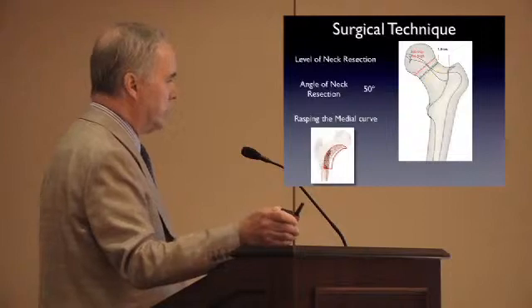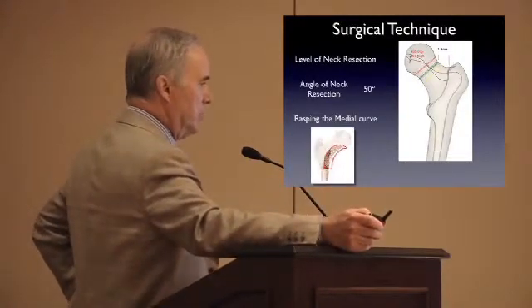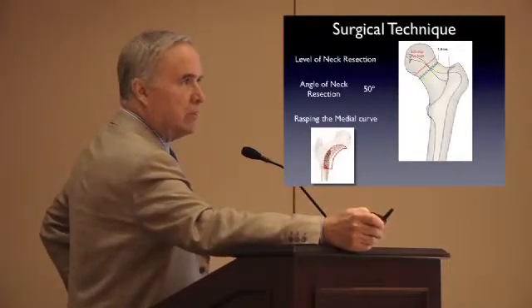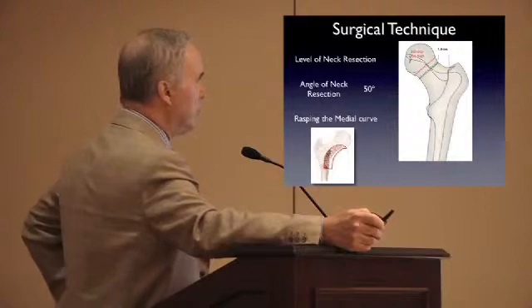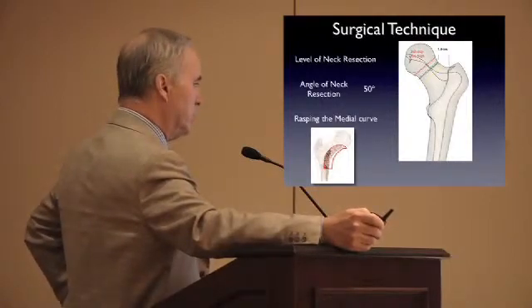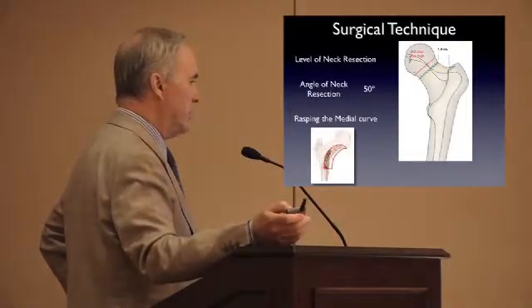With respect to the surgical technique, not to be redundant, but again, you're looking at the line associated with the osteophytes. Make your neck resection. I think it's a little bit steeper than you typically would, and then you're just preparing the medial calcar.